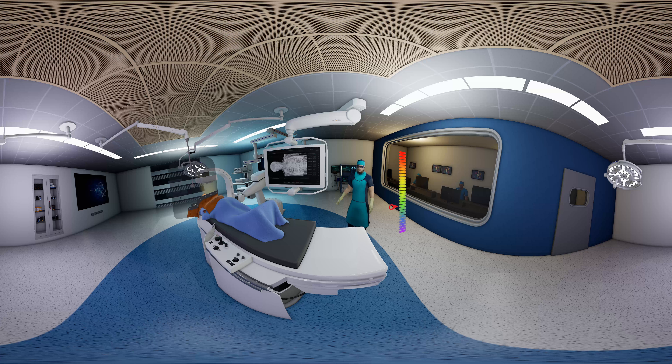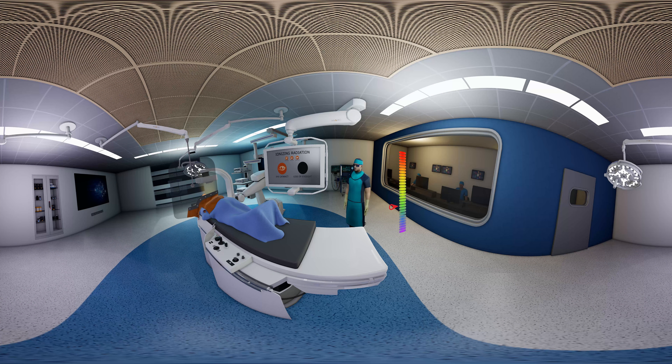Now let's watch a short video about x-ray risks. Ionizing radiation may lead to brain, skin, and thyroid cancers and eye cataracts. Is your vision blurred? This is how x-ray may cause cataracts and eventually lead to complete loss of eyesight. This time it's temporary and you can see normally again.